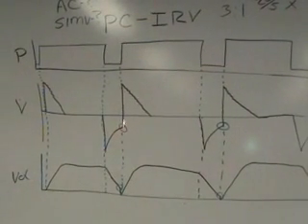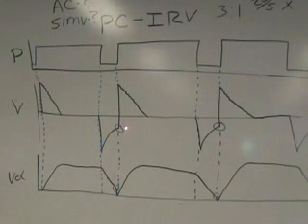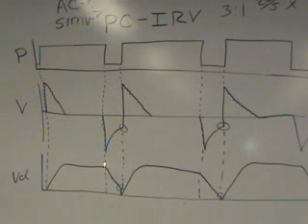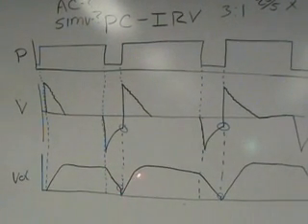But the fact of the matter is my expiratory time is so short, and I want to keep my alveoli open, I will reestablish my inspiratory pressure and not allow my patient to fully exhale, not allow all the volume to completely come back out before my next breath.